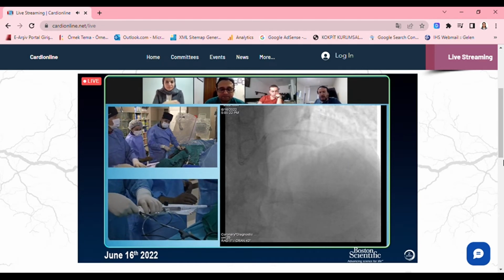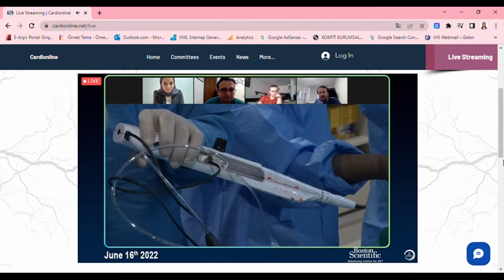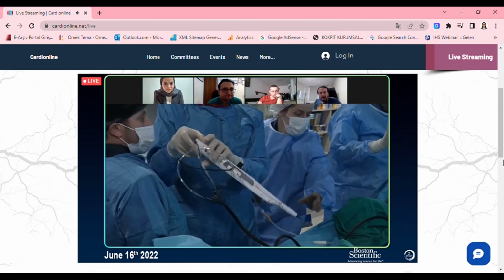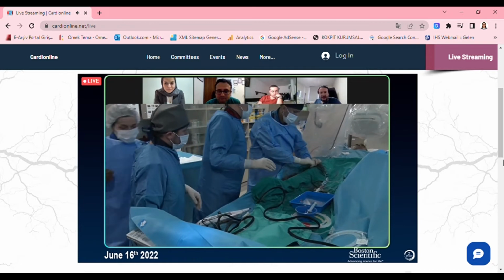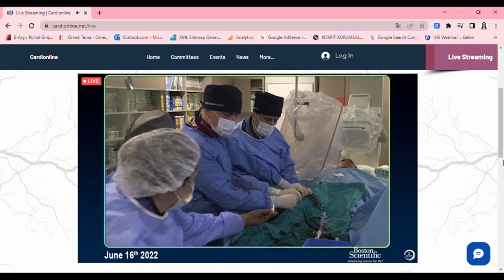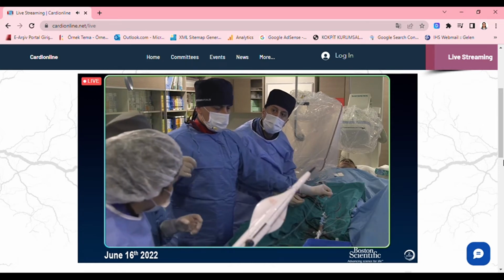The dyno should be pressed till the ball comes out. Yes, it's dynaglide mode. If you do it early, then the ball gets stuck again in the wire, so you have to pull everything out. Okay, you can remove it. Everything I am mentioning has happened to me. So that's experience. I can also give you some insights about my stucks. I had a lot of stucks.